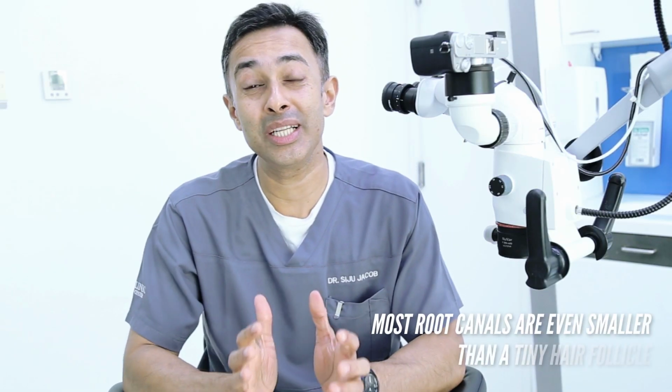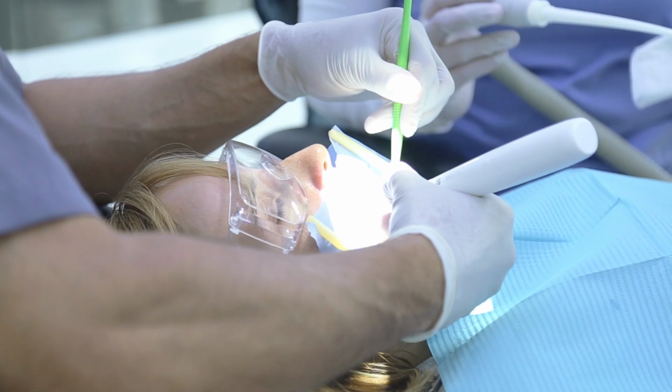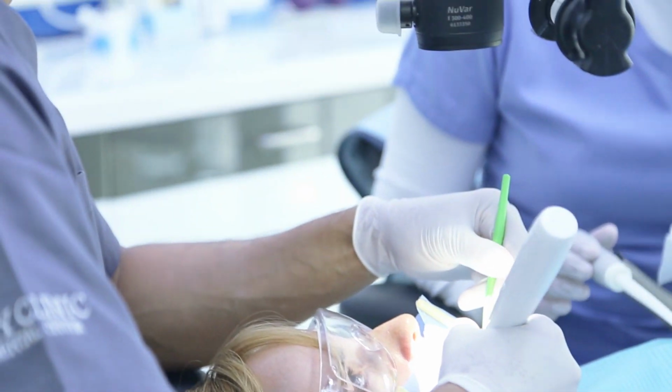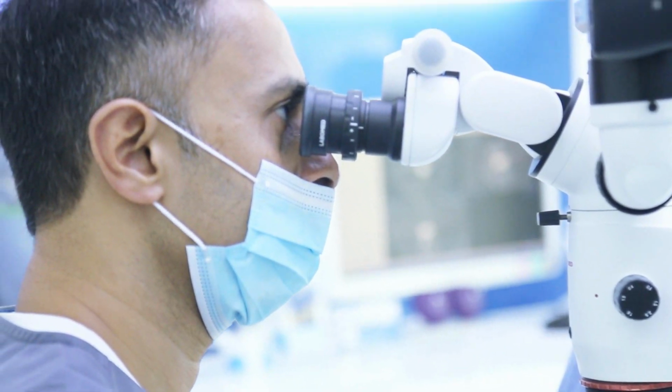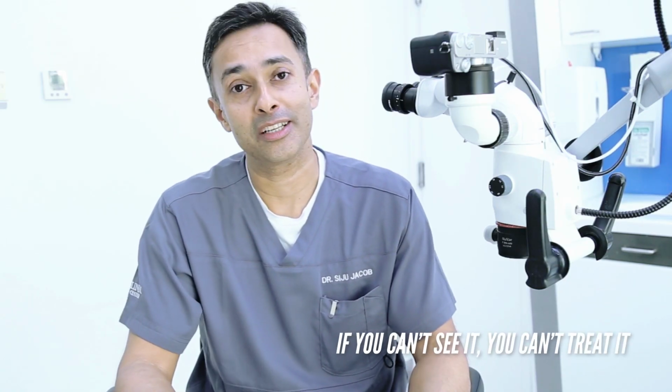Now, what you need to understand is most root canals are actually even smaller than this tiny hair follicle. So if you aren't using a surgical microscope for root canal treatment, chances are you are going to miss a lot of anatomy. And if you miss a lot of anatomy, then you have a higher chance of the root canal failing. So if you have a root canal treatment that is to be done, then it makes sense to do it under the microscope. Because if you can't see it, you just can't treat it.